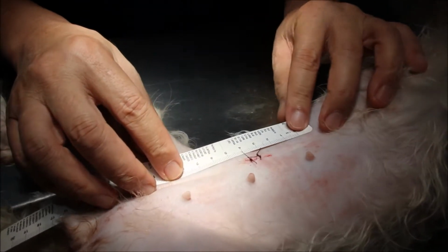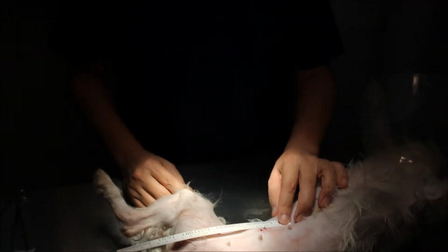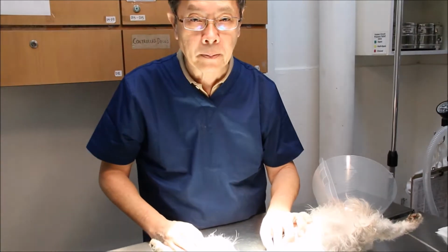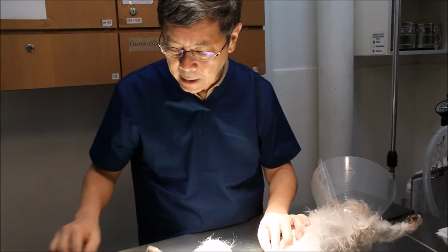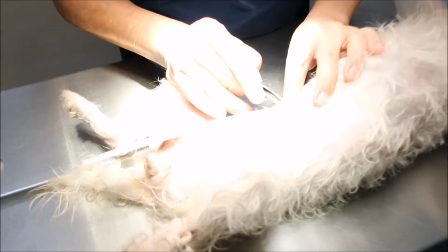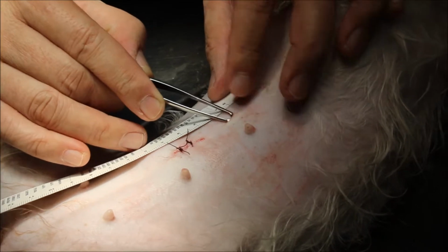Okay, the spay has been done about half an hour ago, and I'm doing a video to teach the younger vets how I spay a dog with the minimum length of skin incision. As you can see here, now what I do is I look for the umbilical scar. This umbilical scar, which was where the umbilicus was.